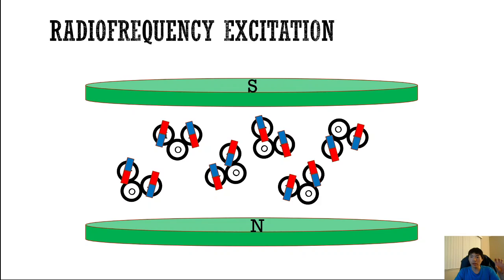So you can imagine a broadcasting station, but instead of using an antenna where you broadcast a signal sideways and in all directions, with a coil, you're broadcasting the radio signal in a more directed manner into our object. And kind of like ultrasound, you can use the same radio frequency coil to receive the response as well.